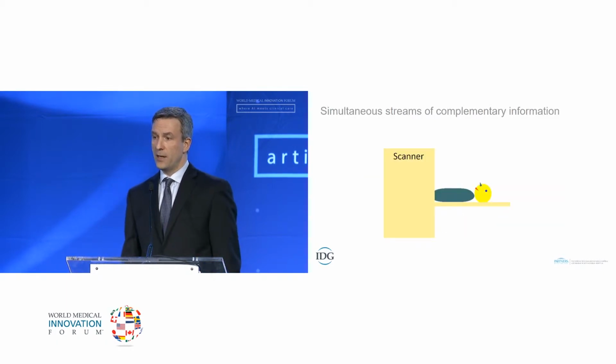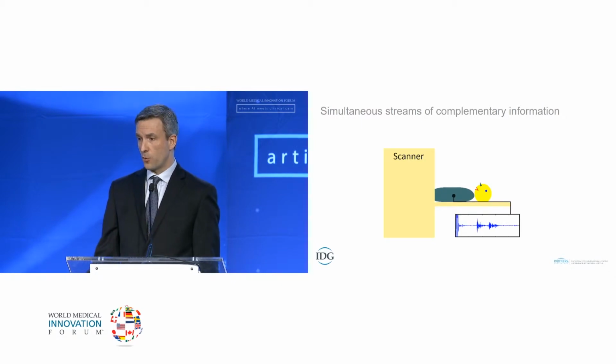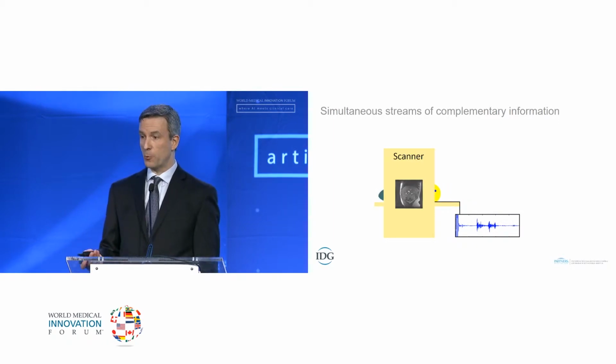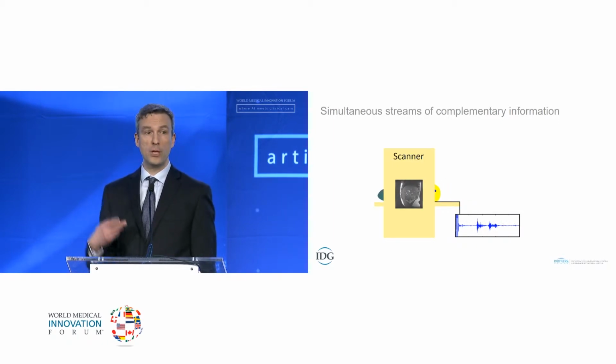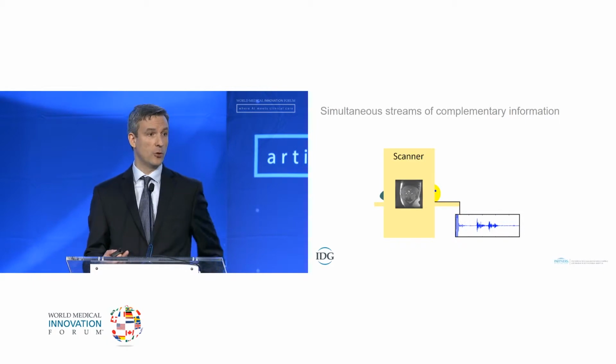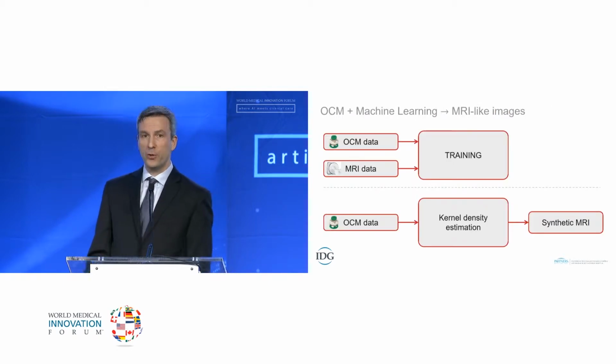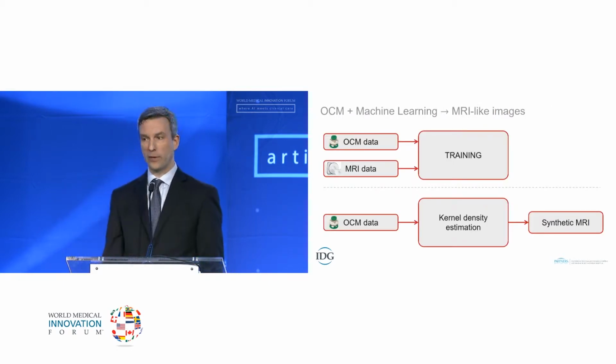So the general idea is that 1 or more sensors are placed on a patient, and then they accompany him or her to an imaging exam. And at this point in time, we now have separate streams of information coming in, and the goal is to have a machine learning algorithm that interprets these streams of data. I'll talk about 3 different examples or ways of doing that.